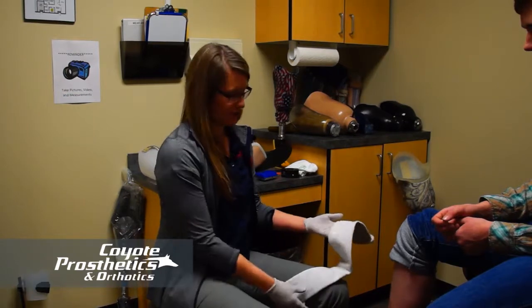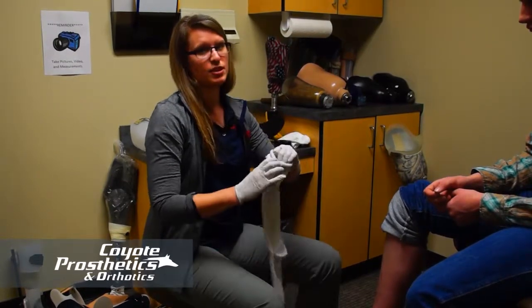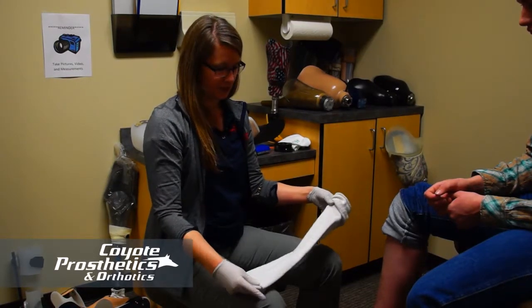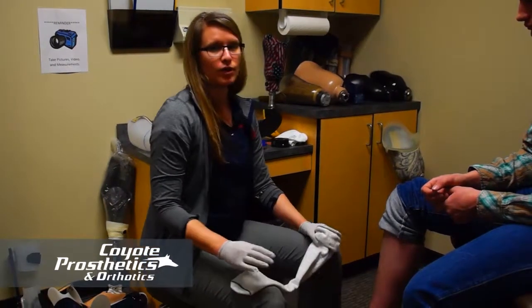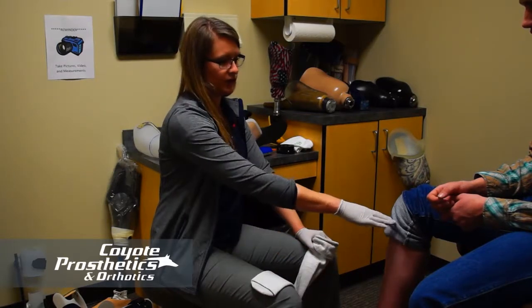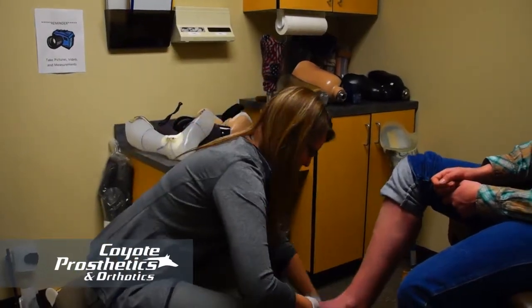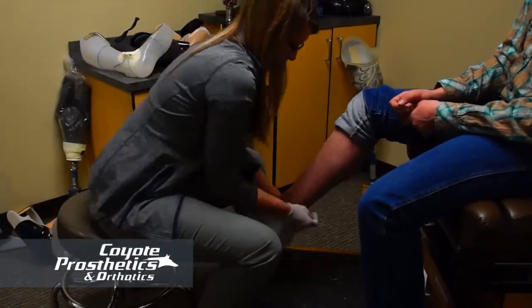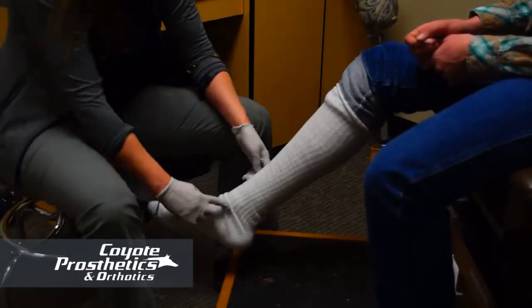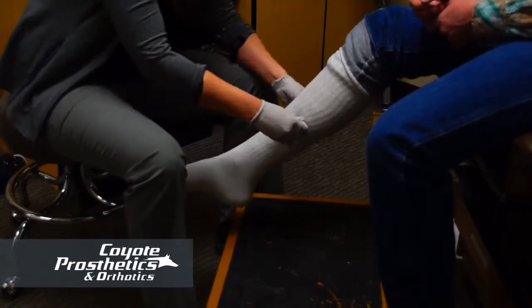The first thing we're going to do is start with a sock — specifically an AFO sock. It's made to be moisture wicking and has silver fibers in it to reduce bacteria. This one is a nice tall sock so that it will go higher than the brace. You don't have to have a special AFO sock, but you definitely want your sock to go taller than your brace to reduce any friction or rubbing. Make sure there are no wrinkles in the sock, as that can cause skin problems underneath the brace.